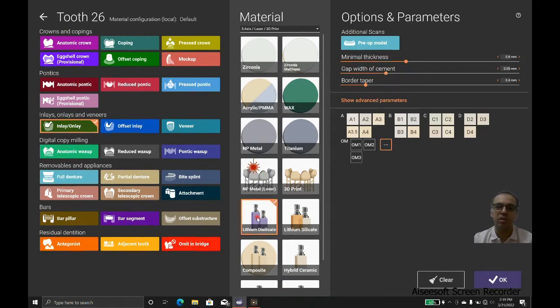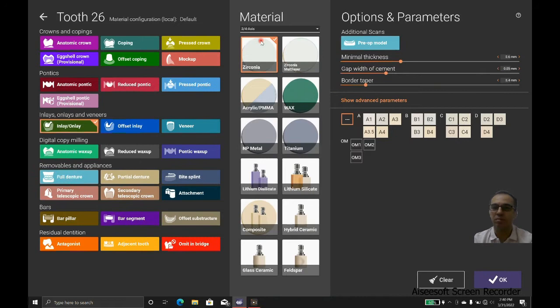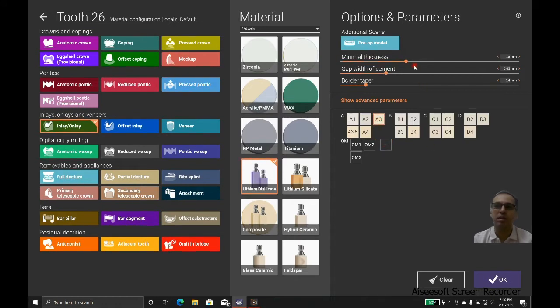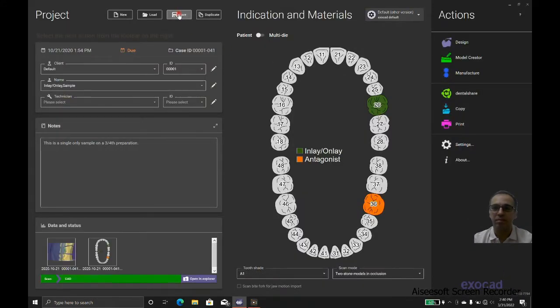We choose lithium disilicate and select three-axis machine. We should choose lithium disilicate again because we changed the machine. After that, we check the presets: 0.8 for minimal thickness and 0.05 for the gap.